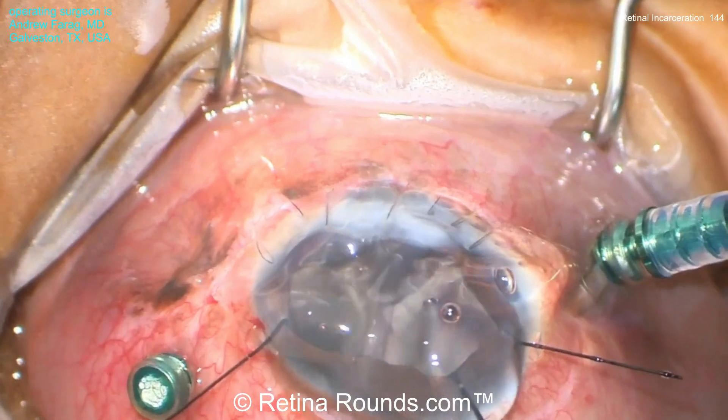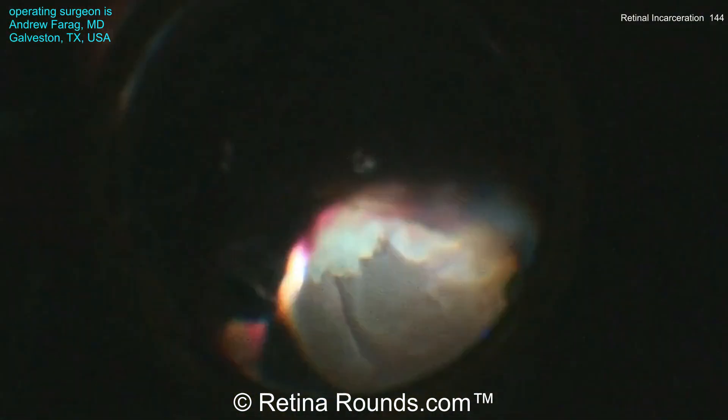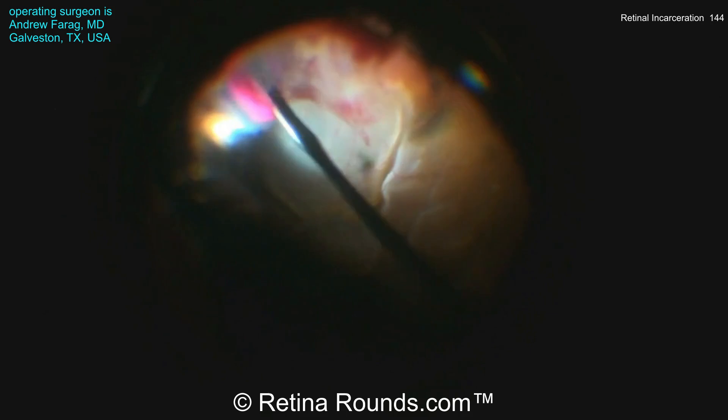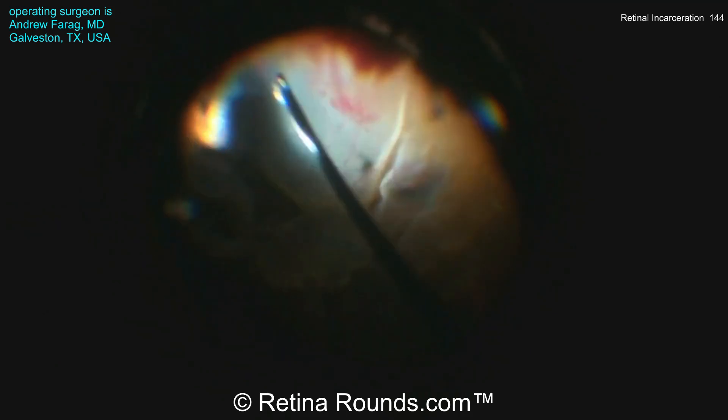It's important to maintain good visualization. I like the extra steps Dr. Farag is taking so that he can see well in the posterior segment — you can't perform good surgery without good visualization.